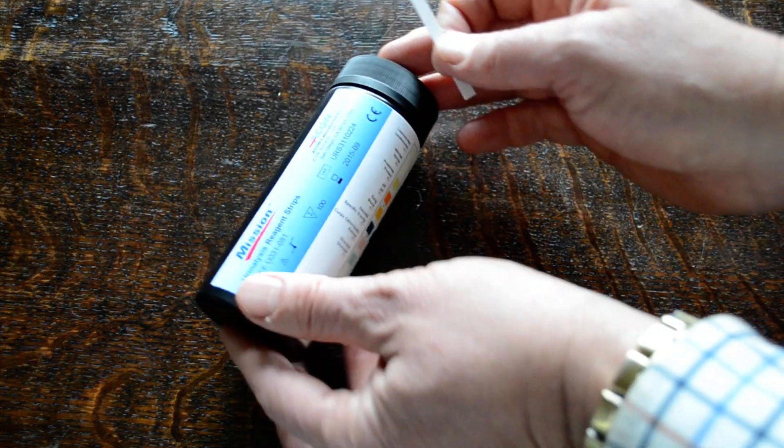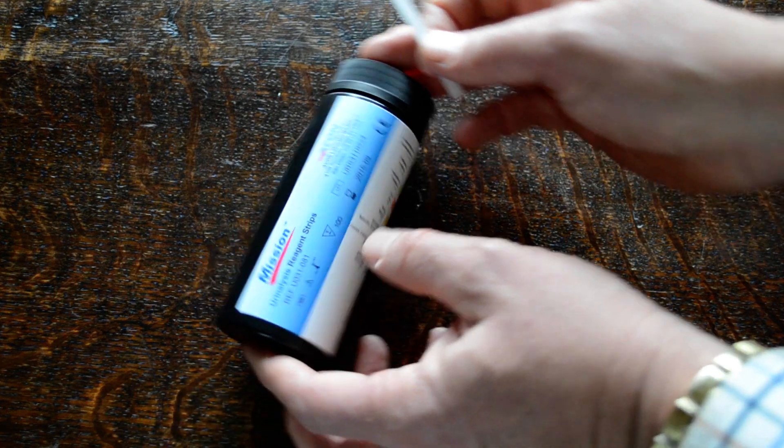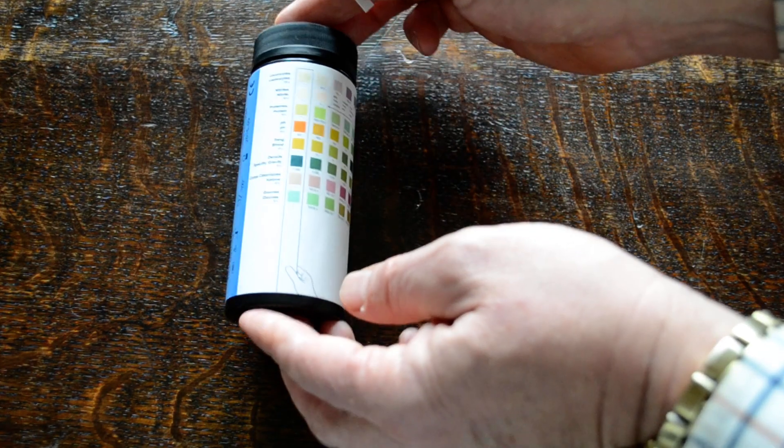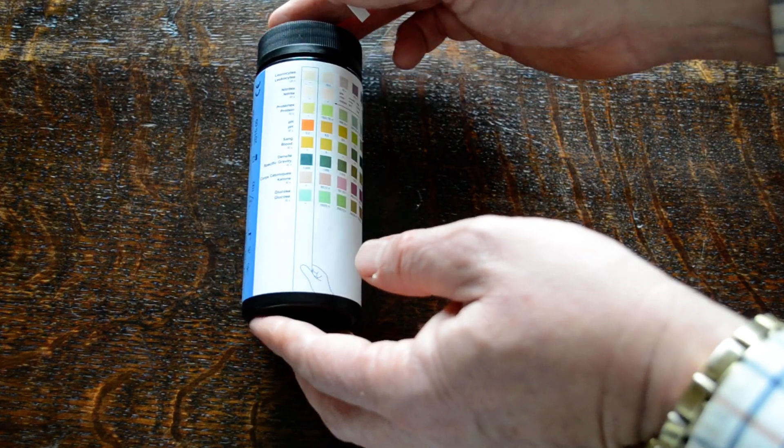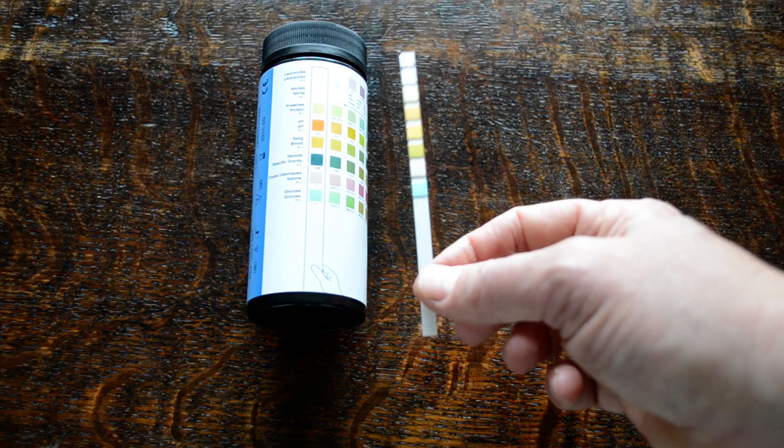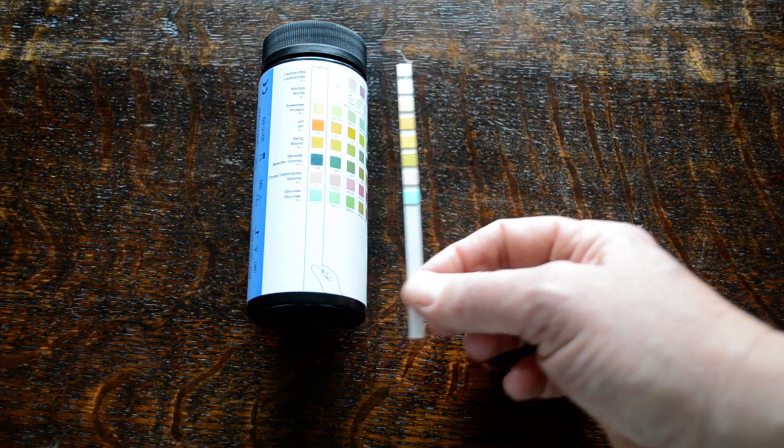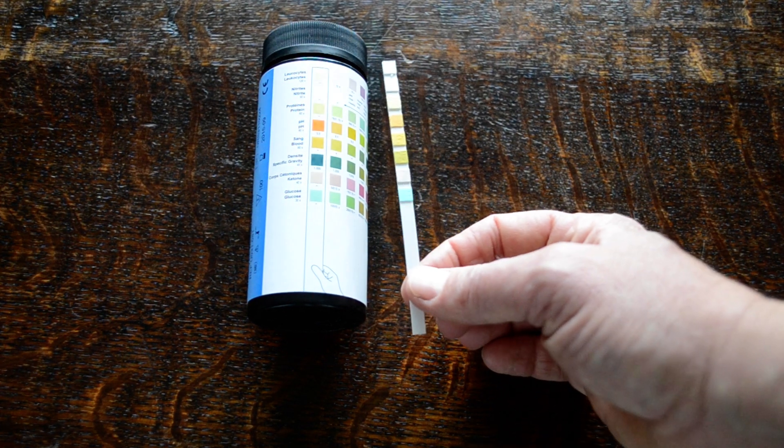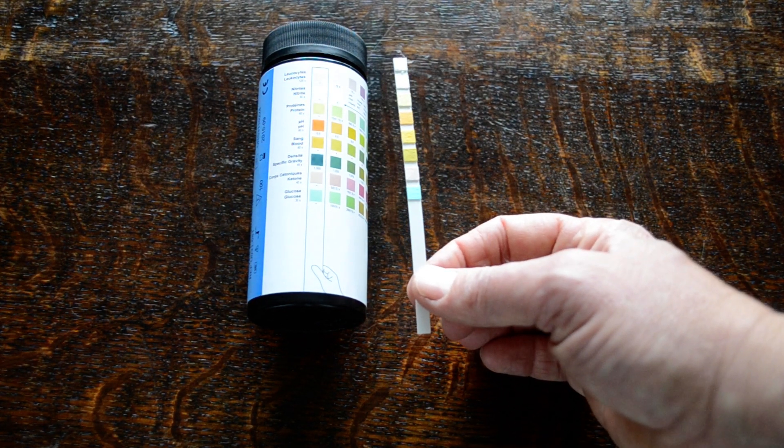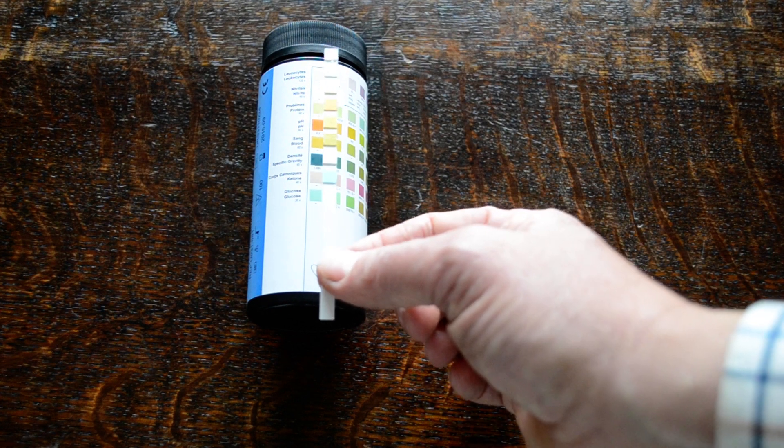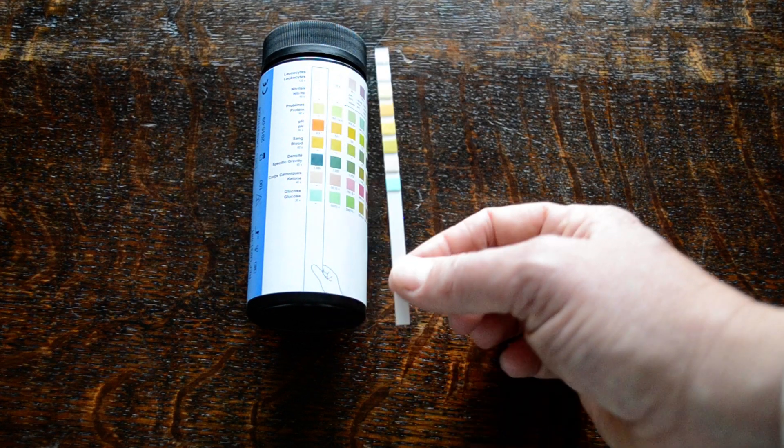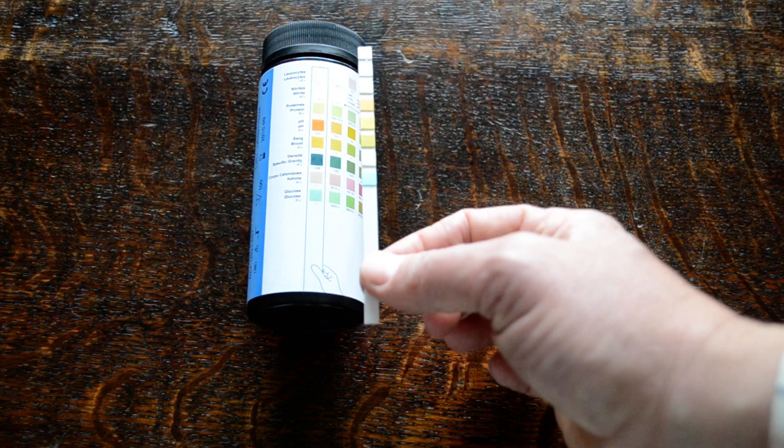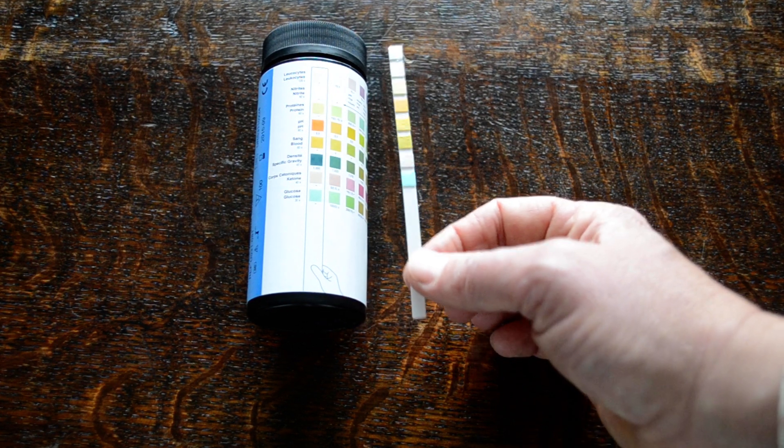Despite the expiry being very good on most of these test products, you do need to be aware that if they've absorbed moisture environmentally, then they're not going to be in prime condition and may not be good to test. So if it comes out and doesn't match some of these parameters on that all-negative test, with the exception of specific gravity, we would say buy some new tests.